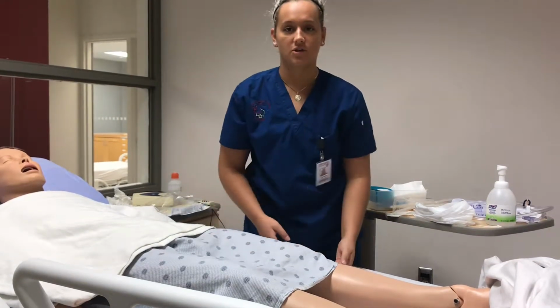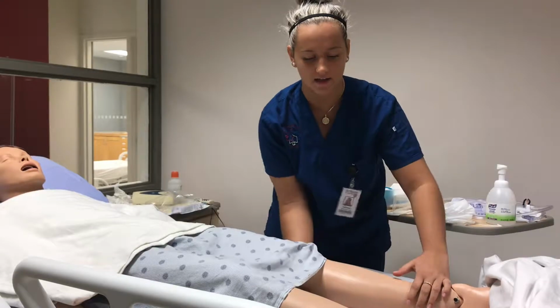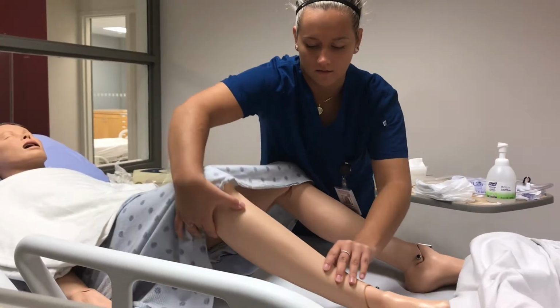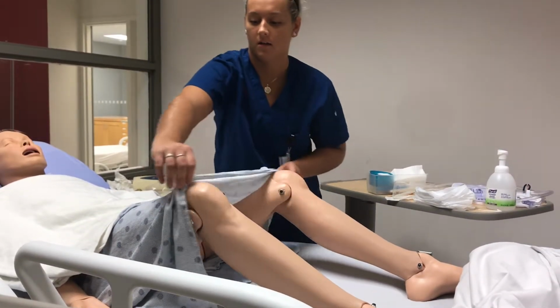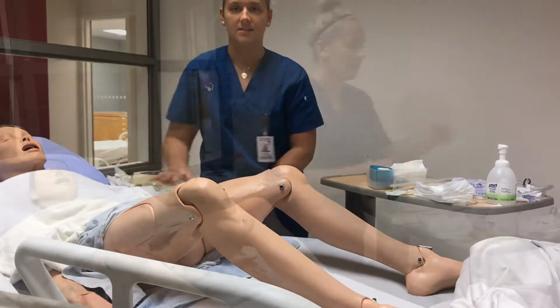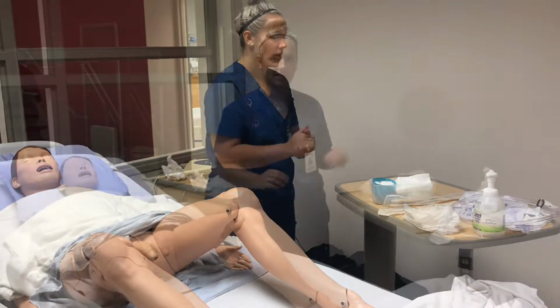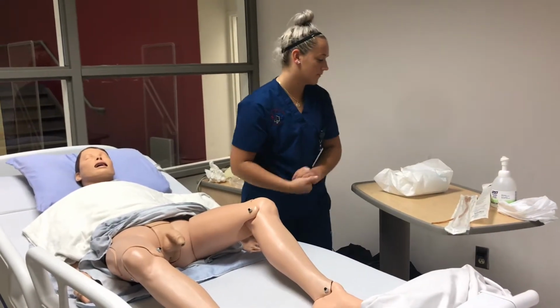And you're gonna wanna make sure that the patient's in a supine position with his legs abducted, so bent upwards. And then you're gonna wanna open the gown, and perform hand hygiene. And so I have my kit ready here. So before I begin, I'm gonna perform hand hygiene.